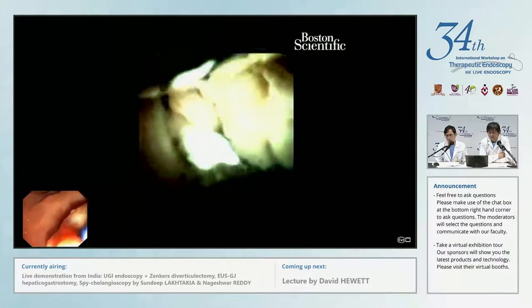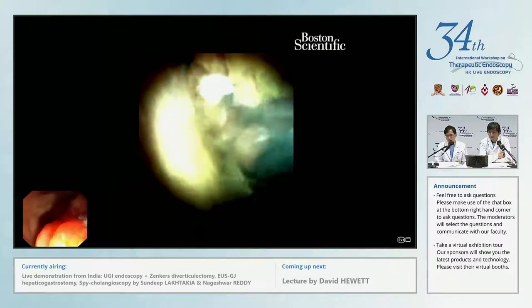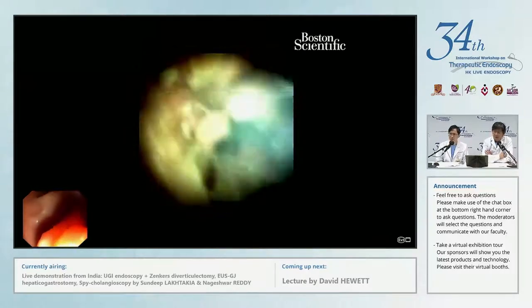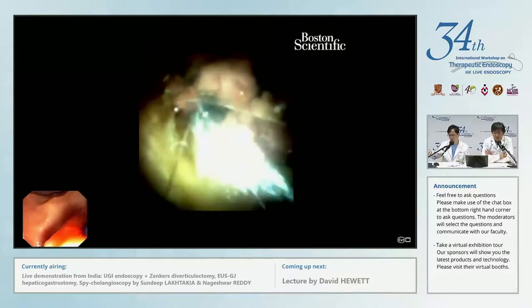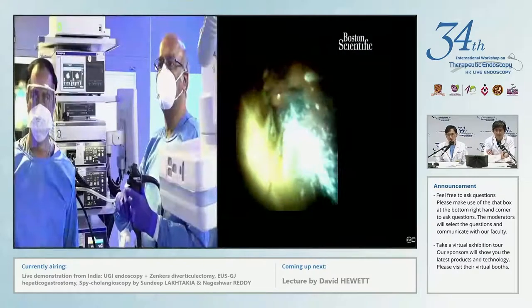Of course, we would do another assessment in this case like EUS and maybe a PET also before he goes for this radical surgery. You agree, James? Yes. I'm just wondering whether you're going to biopsy these nodules. Yeah, we were going to biopsy it, normally, with such a dramatic appearance.